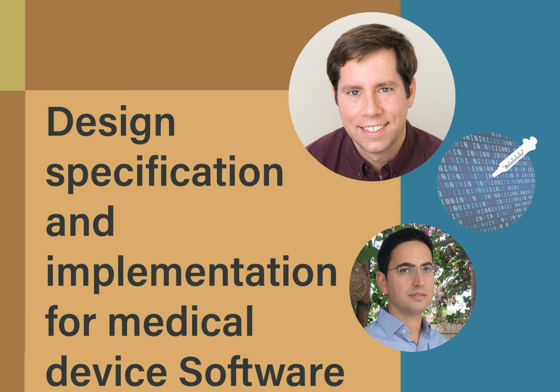So I think as long as people insist on having a documented design and having evidence of a good, strong review of that design, that's probably enough to make sure they don't fall into that trap. Because if anyone ever quickly codes up a prototype proof of concept and then that gets accepted as production quality, kind of by definition, they did not do a review of the design of that module. Does that make sense? So I think having the documented design and having the review of that design is enough to keep you from falling into that trap.